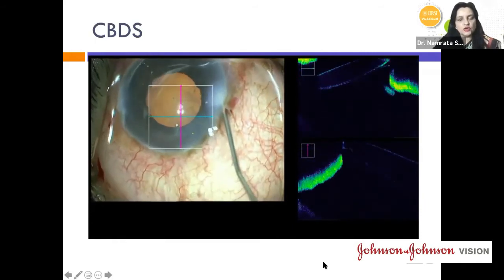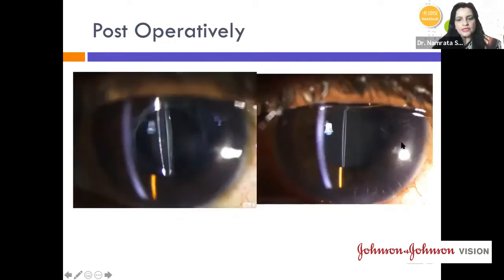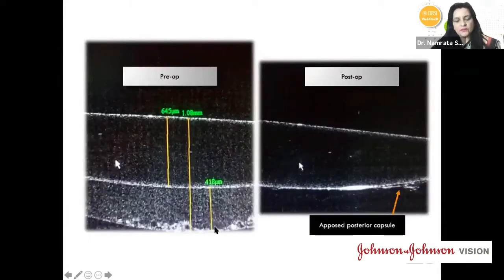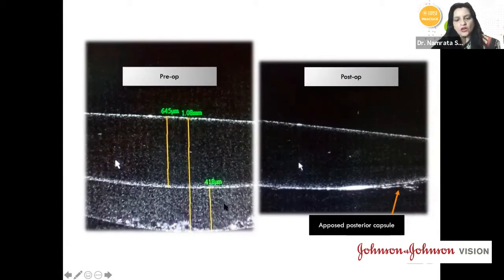Post-operatively, there is no gap in the retro-pseudophakic space. Comparing pre- and post-op anterior segment OCT confirms the gap is completely eliminated. Classically, a YAG capsulotomy is described for capsular bag distension syndrome, but in this case YAG was avoided because the patient was a high myope, and the intraop OCT microscope allowed direct visualization and aspiration of the fluid behind the IOL.